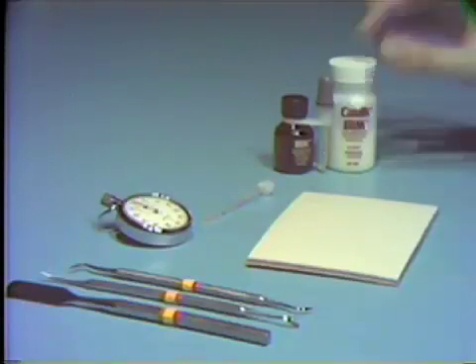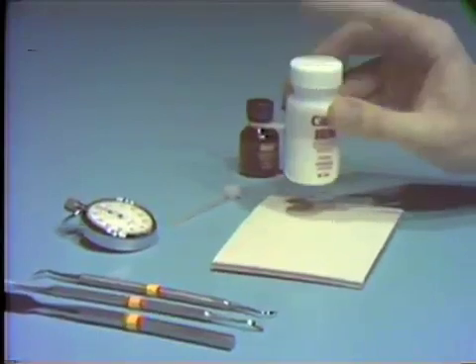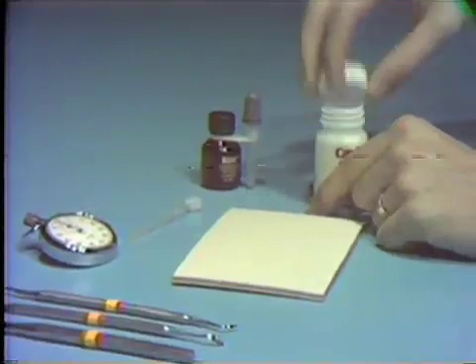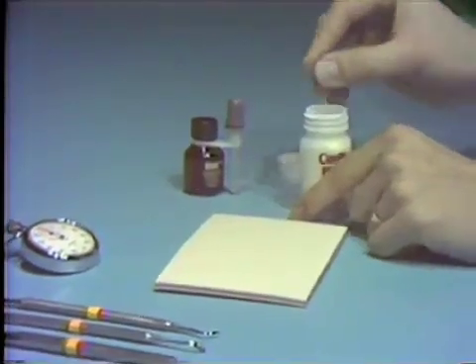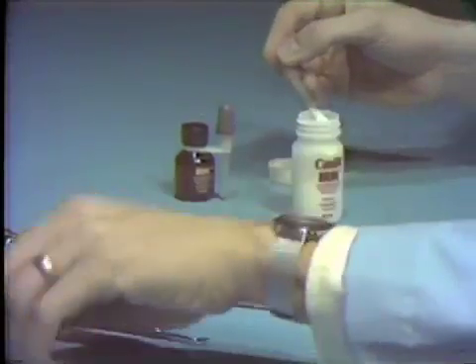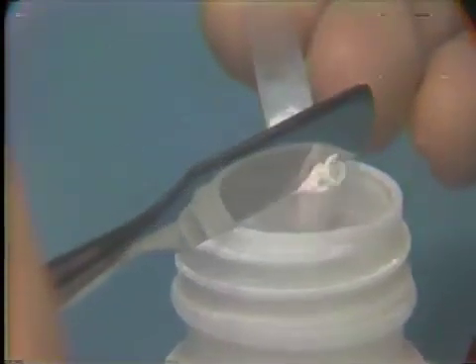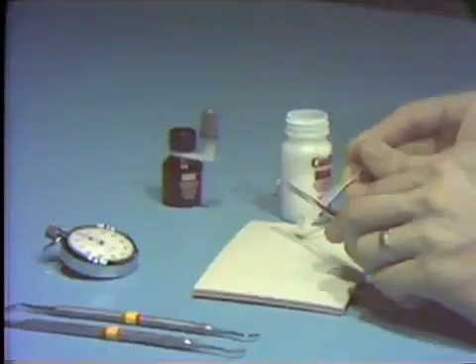In dispensing the powder onto the pad, the powder should be fluffed lightly in the bottle to ensure uniform density during measuring. The measuring scoop is filled to excess without packing, then leveled of excess powder using the flat edge of the mixing spatula, and the powder is dispensed onto the center of the mixing pad.